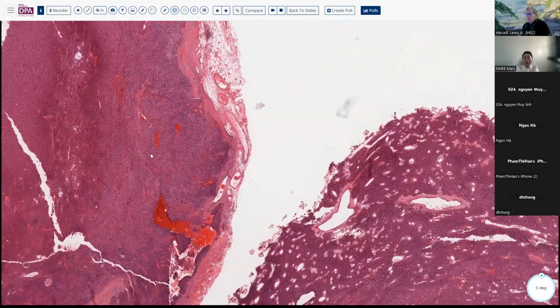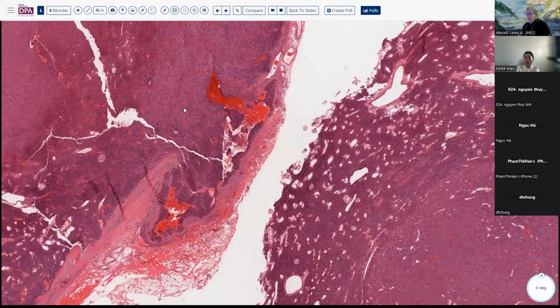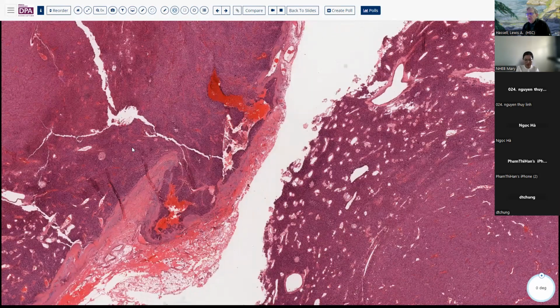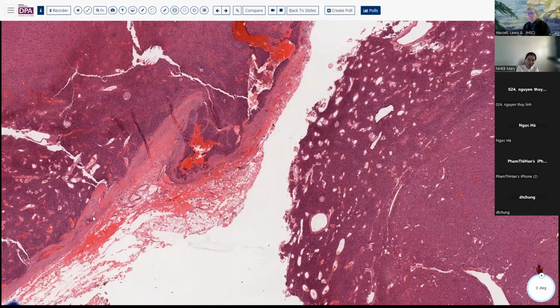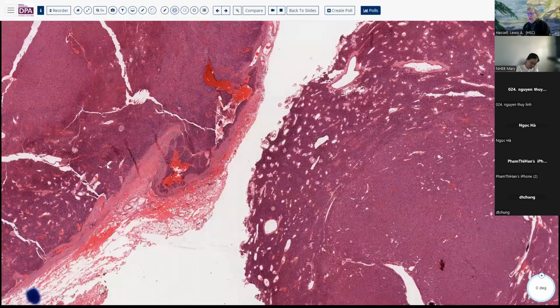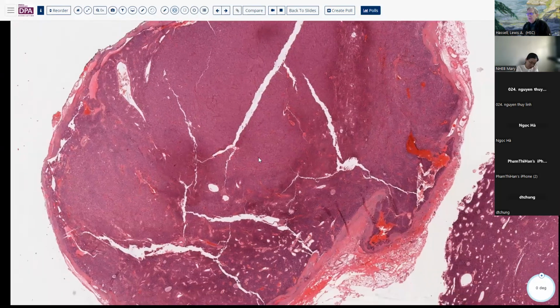So in addition to the criterion of vascular invasion, another very firm criterion is invasion of adjacent tissues, adjacent organs. So invasion into the thyroid, or invasion into skeletal muscle, or clear-cut invasion even into fatty tissue could be grounds for identifying it as malignant.